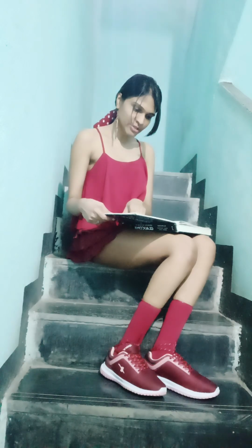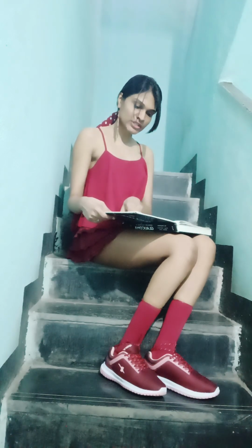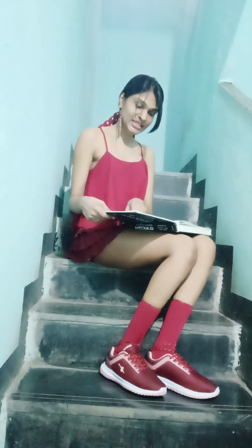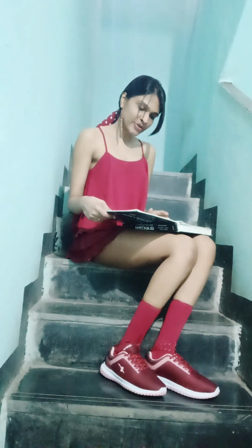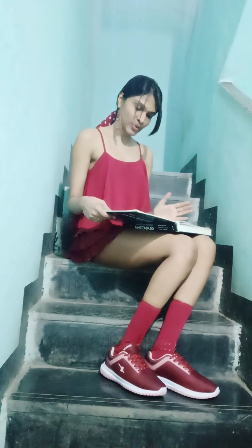So ciliary body band. The ciliary body band is the portion of ciliary body visible in the anterior chamber as a result of the iris insertion into the ciliary body. The width of the band depends on the level of iris insertion and tends to be wider in myopic eyes. In myopic eyes, the anterior chamber is deeper, and narrower in hyperopic eyes. The color of the band is usually gray or dark brown.